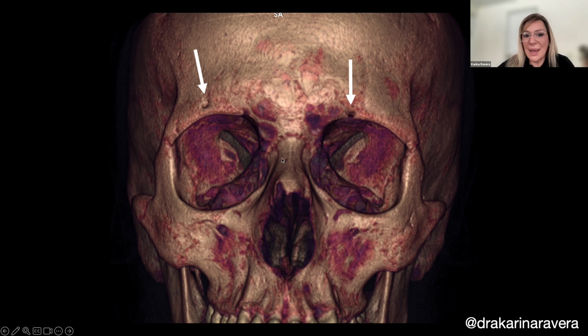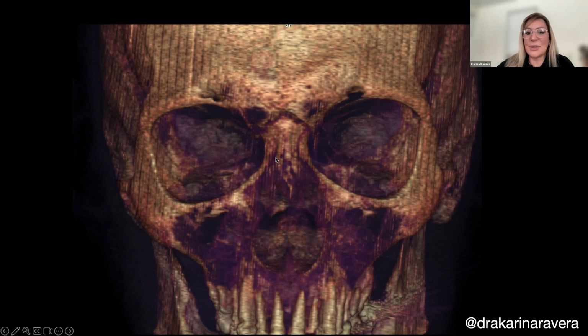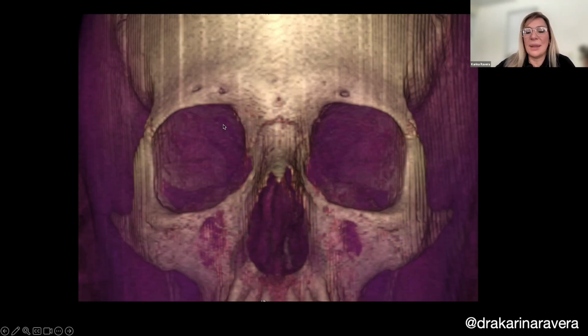And I want to highlight that this area is one of the most dangerous zones in the face because our patients can become blind. And these arteries or bundles are the most variable in our patients. Yes, that's why the ultrasound examination is very important. In this case, we have a notch, and in the other side, we have a foramen. The variations are the rule.